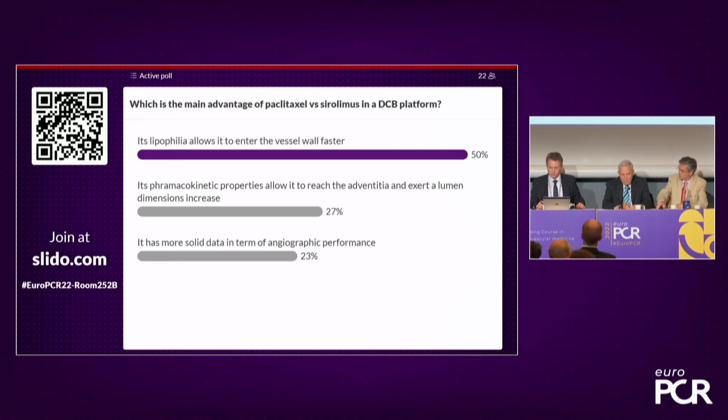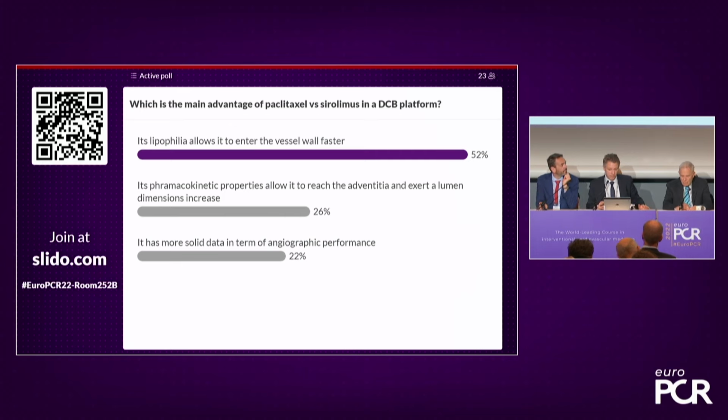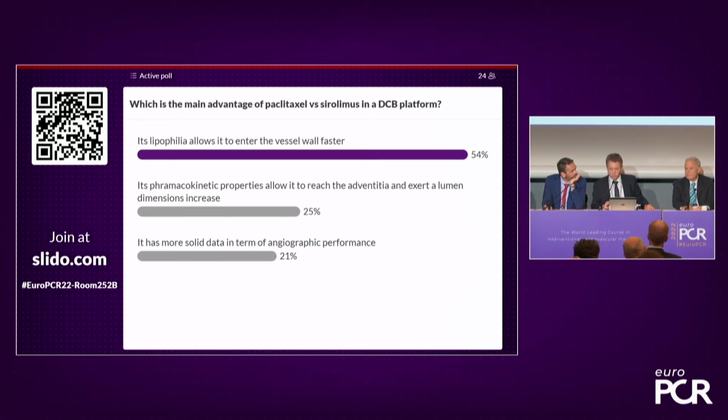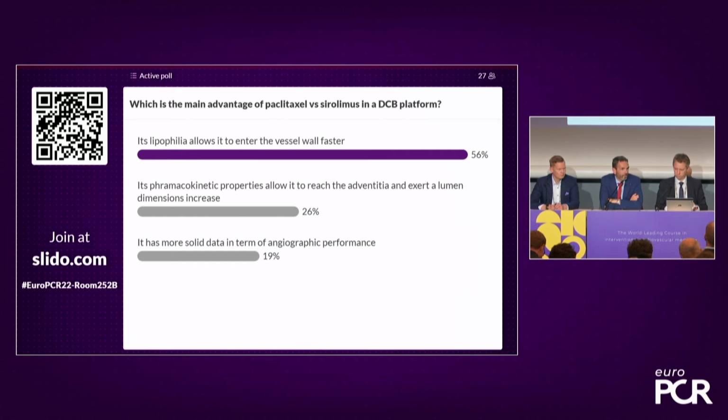And John showed a nice case. If you've got CTO, then you can go longer. Of course, if it's left main, then you're limited, but most of the time 30 seconds, I think, is well tolerated, and then you can give a second inflation. Yeah, minimum of 30 seconds. In the left main, it's more difficult, but many patients may also tolerate up to 60 or even more. So I agree with you.